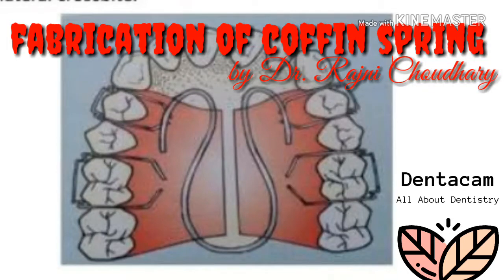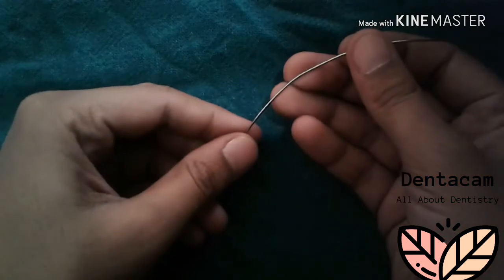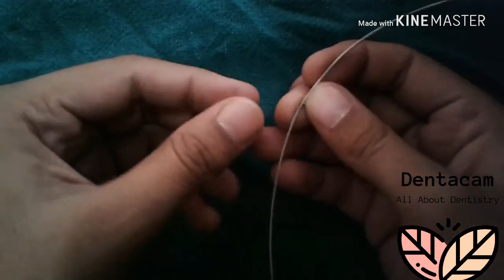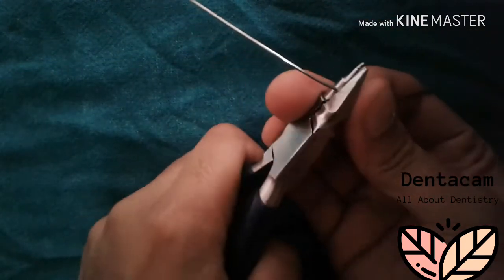Hello guys, today we will discuss the fabrication of the coffin spring. The coffin spring is used for slow dento-alveolar expansion. It is made up of 1.2mm hard stainless steel wire. From the center of the wire, start making a U-loop with a plier or by hand.